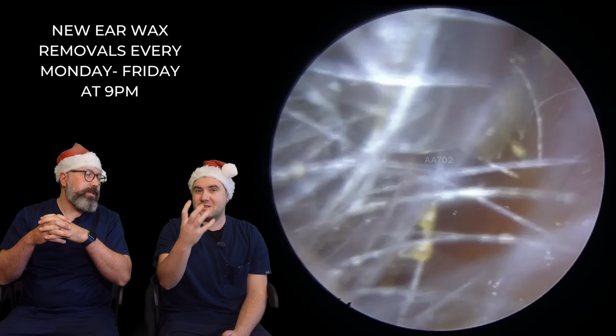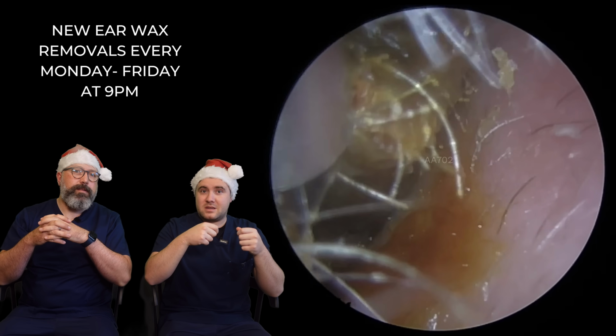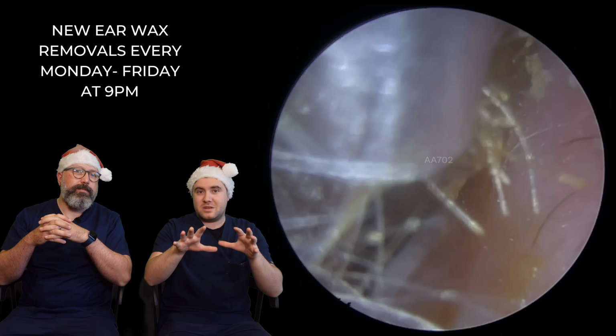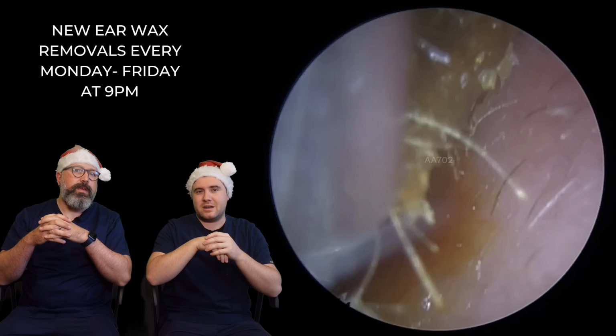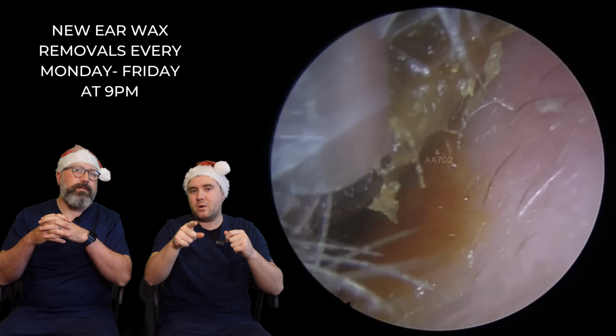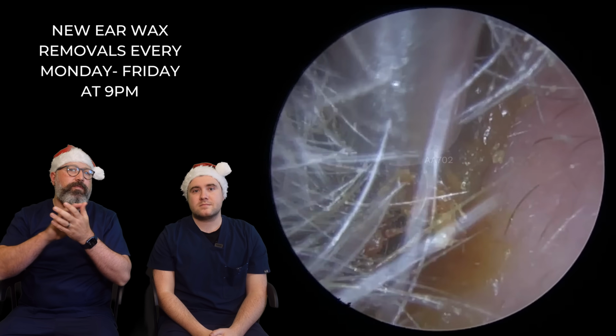It sticks to the cilia. Yeah. And I know we do, in some cases, please never use them yourself, but sometimes we do use a cotton bud to try and mop up some of the oil near the entrance. But we know how far we're going in, so please don't ever use them. And if we were doing that, it's mainly just to take it off those little hairs.